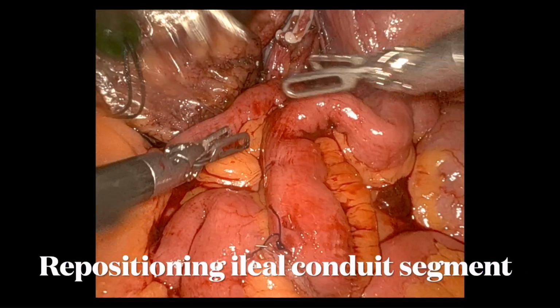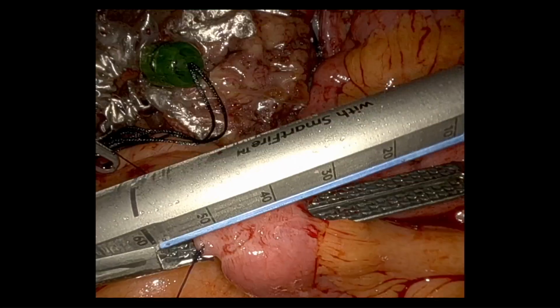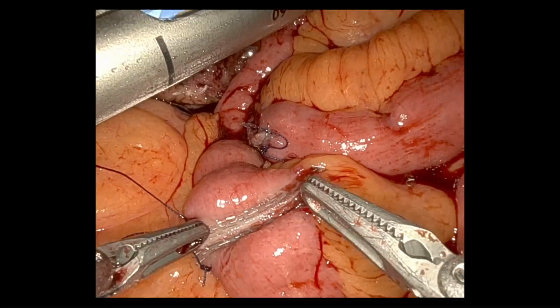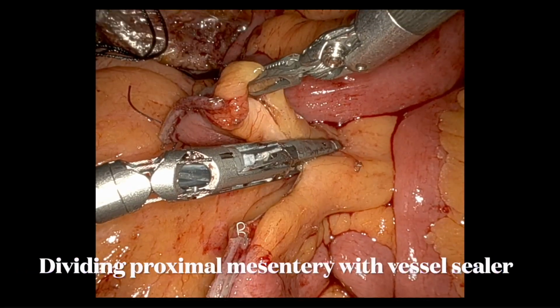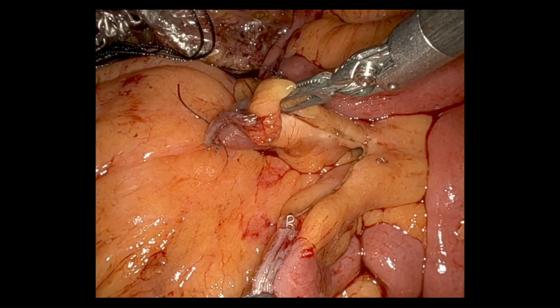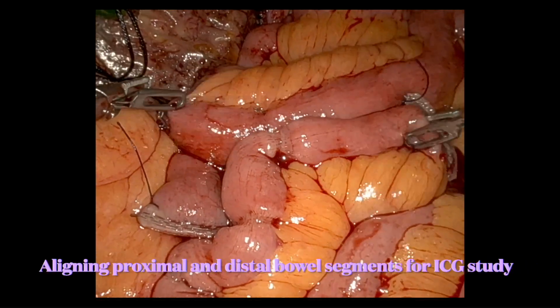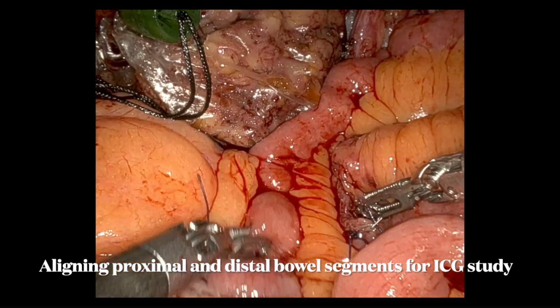Now we divide the proximal part of the bowel using a Sureform 60 stapler, followed by division of the mesentery with the vessel sealer. Following this, we reposition the bowel segment, bringing the distal segment posteriorly and the proximal segment anteriorly for the ICG study. The ileal conduit segment lies posteriorly at this time.